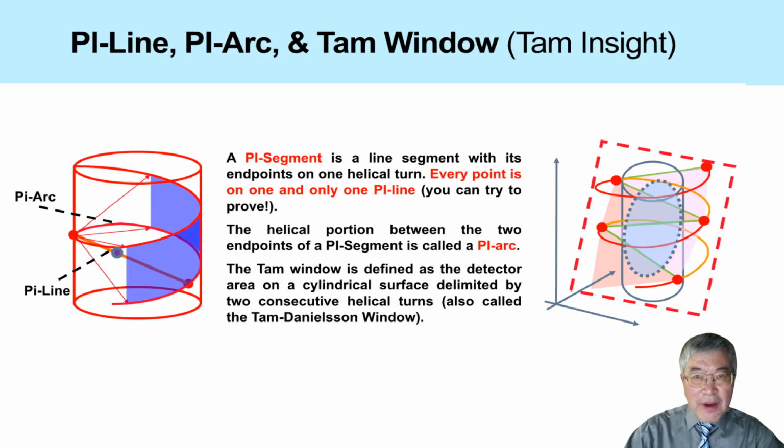If the parabola is very small, then locally the cone angle is also very small. Locally, the cone beam projection can be approximated by a parallel beam projection after applying the proper scaling and weighting corrections. This is the same weak perspective idea we discussed earlier. So for a very small point-like object, we can convert the local cone beam data into the corresponding parallel beam data as accurately as needed.